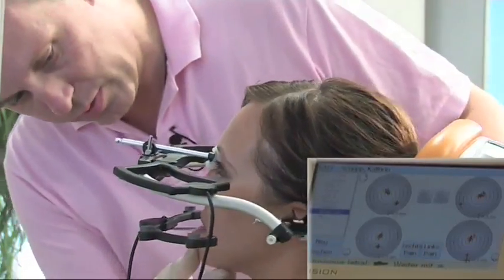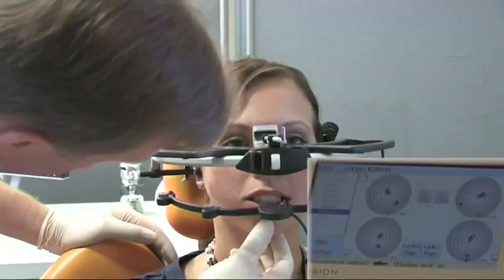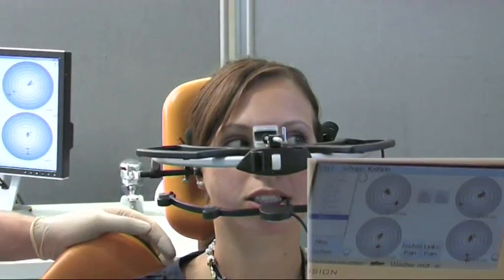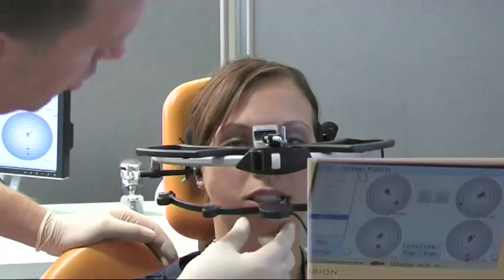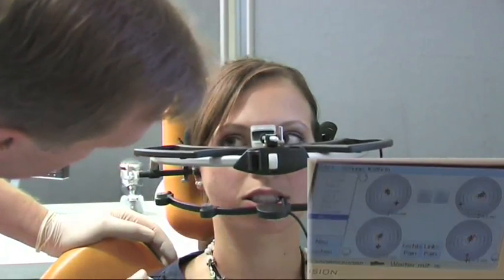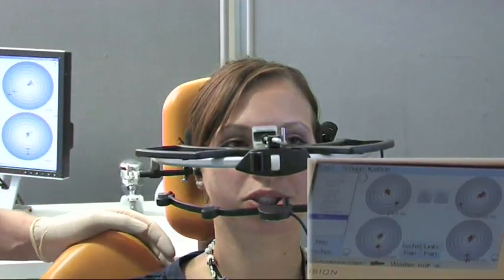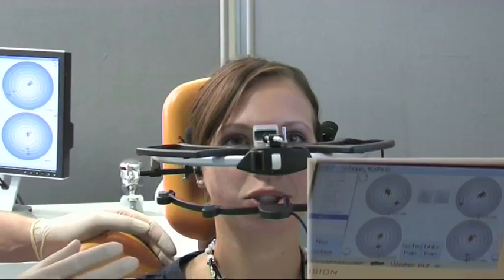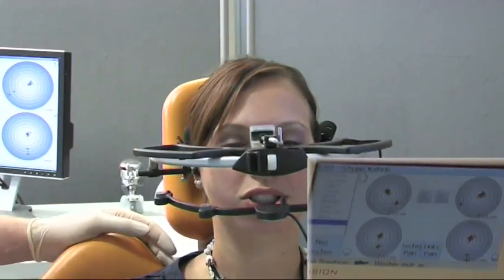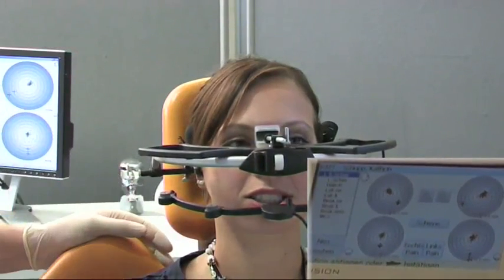OK, close please. Try to move the upper jaw forwards and the lower jaw to the back. Good, perfect. And now suck in your cheeks just like when you are concentrating on the computer. Yes, once again, and hold it so. OK, wonderful. Then we are through with the registration.